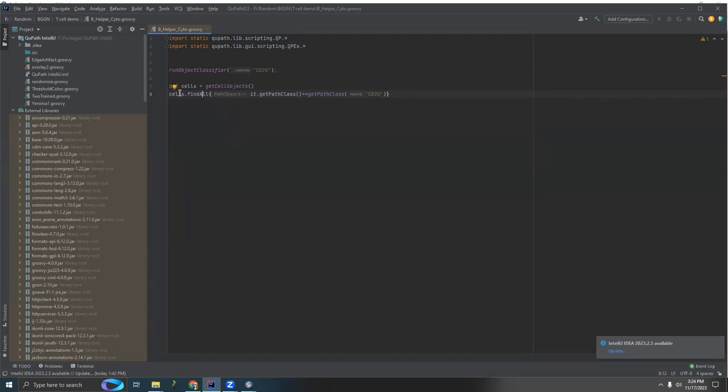So once again, this says look through all of the cells and find the individual cells where their classification, which in QPath is called their path class, is equal to CD20.